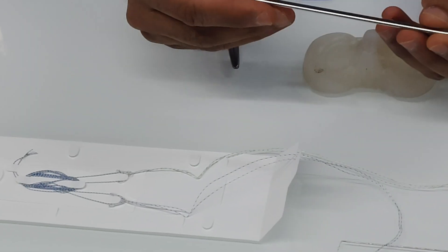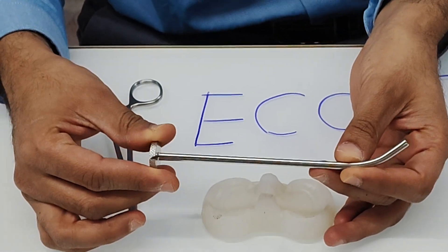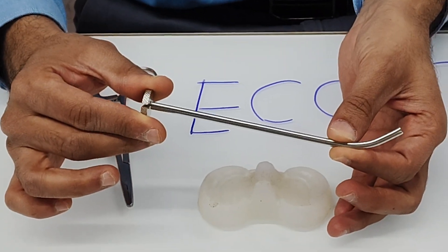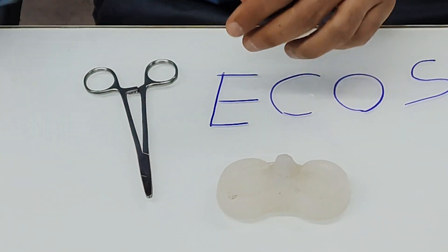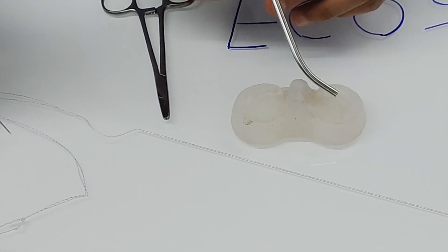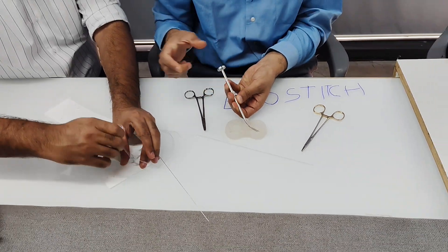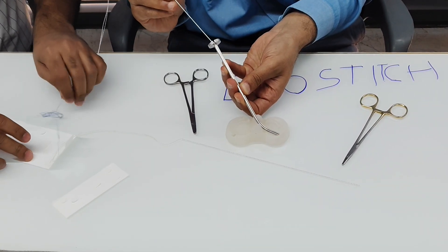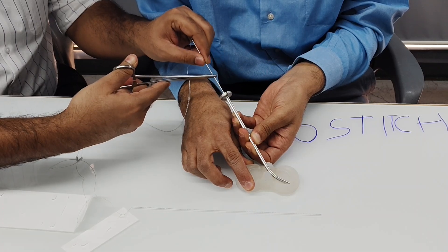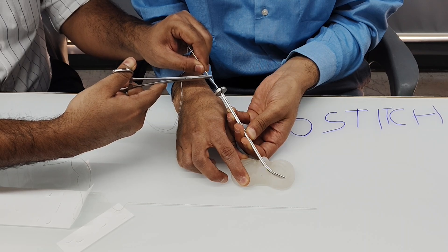This device must be used with a slotted zone-specific cannula, which can be placed at the position of your choice at the anchor of your choice. We keep it at its place like this, and then ask the assistant to pass the needle through the meniscus.